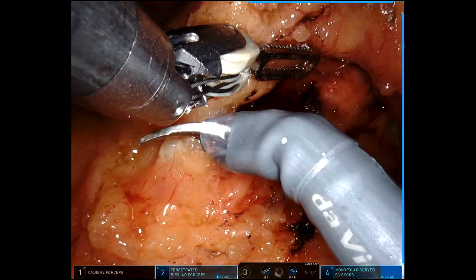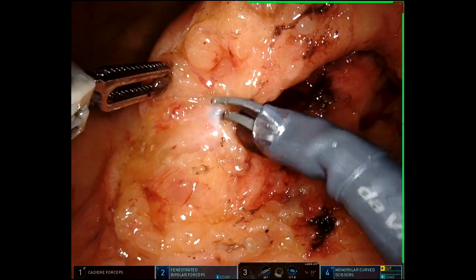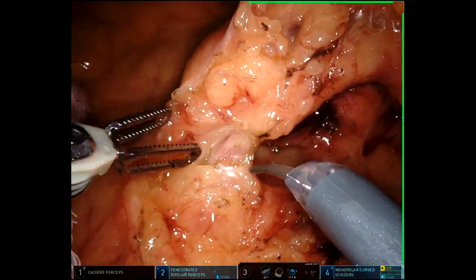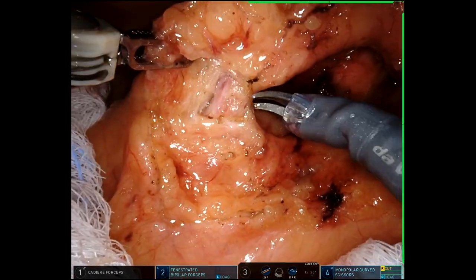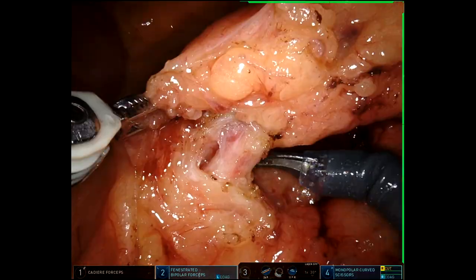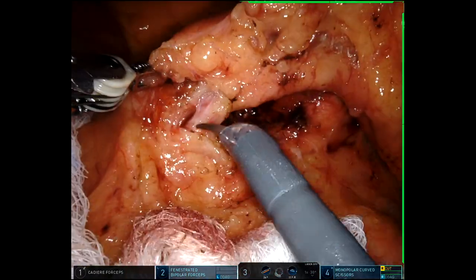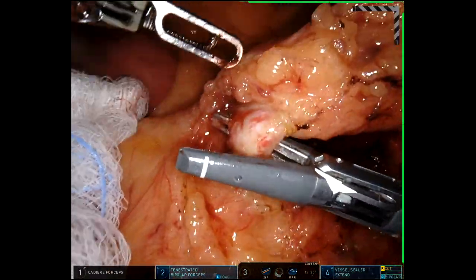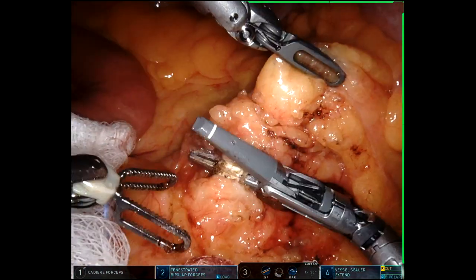For cancer cases, I usually make every attempt I can to take the IMA pedicle proximal to the left colics. I've isolated that here, and I try to make a nice window around the pedicle. I really like to clean a lot of the fat off of the vessel before I take it to make sure I get a good seal, particularly with that warning we've heard about lately with the vessel sealer. I think it's good practice. Now I take the tension off and divide the IMA.